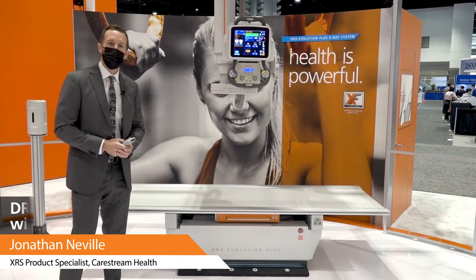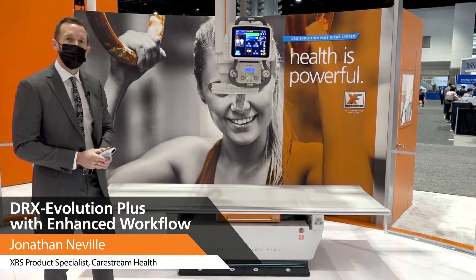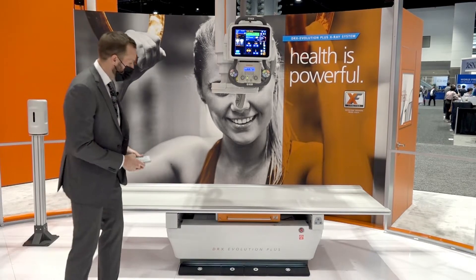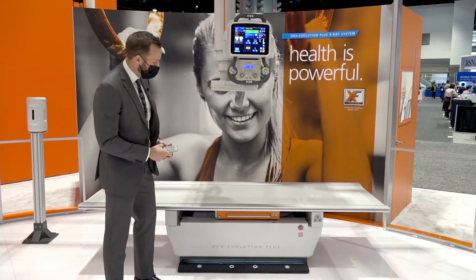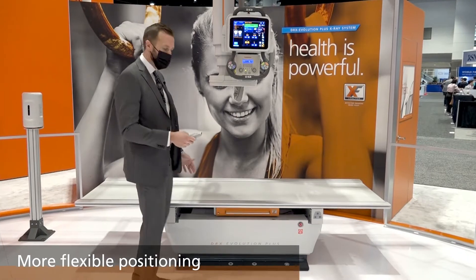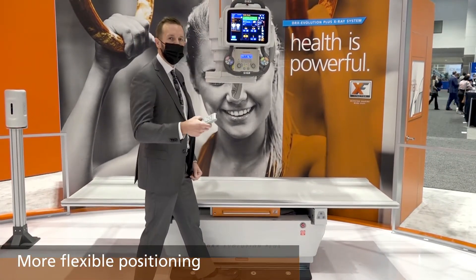Hi, I'm Jonathan Neville with CareStream Health, and today I'm going to walk you through some of the hardware revisions we've made with our DRX Evolution Plus Premium DR for 2021. We've made some adjustments to our table that allows for more flexible positioning. The table is actually able to drop about half an inch lower, as well as raise roughly two inches higher.